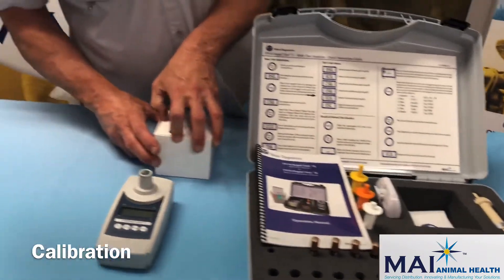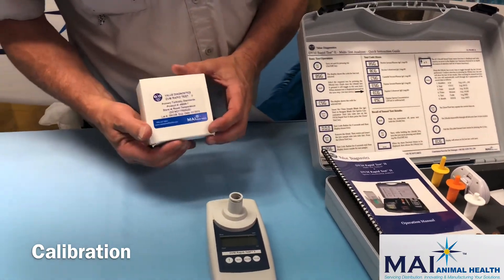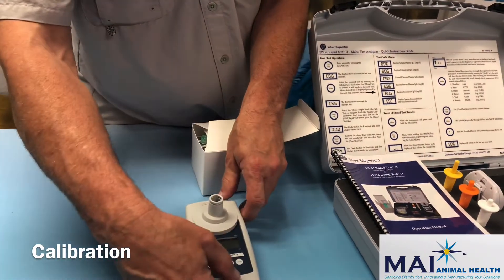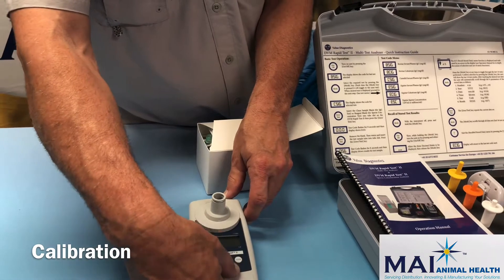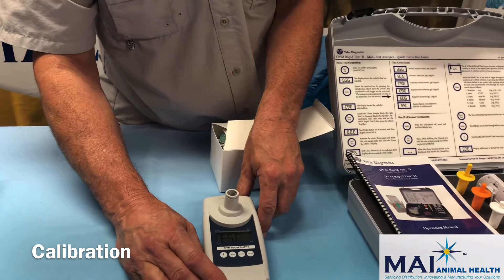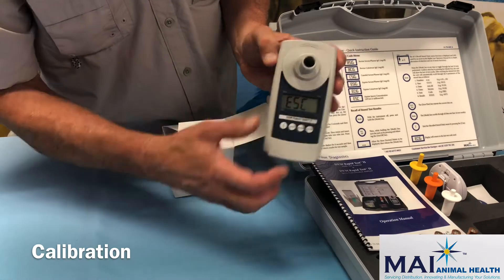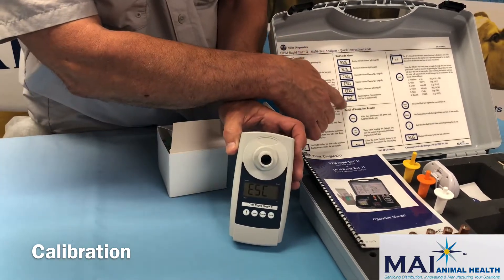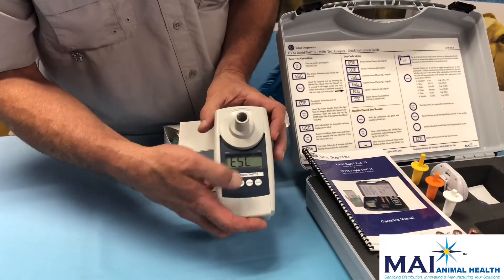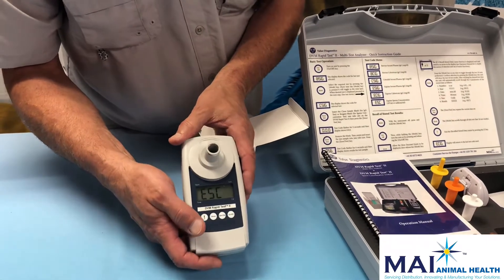The first thing we need to do is check the calibration of our instrument. The calibration test is performed using the turbidity standards included with the kit. We turn the instrument on by pressing the on/off button, and a test designation comes up — one of the tests listed on the instruction sheet. ESC stands for equine sperm concentration, and that is the program used to check the turbidity standards.